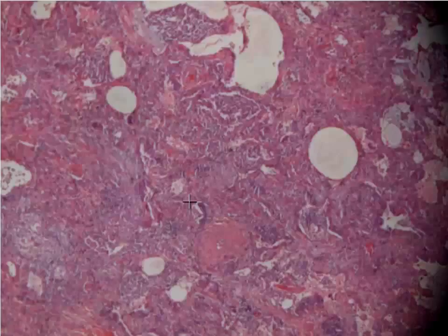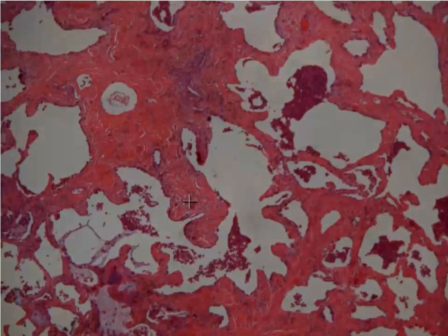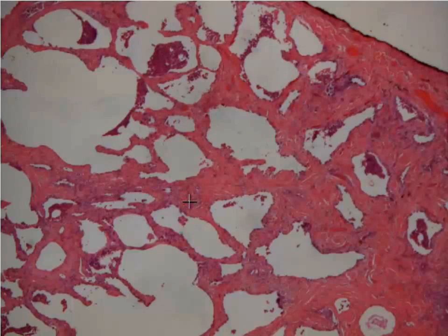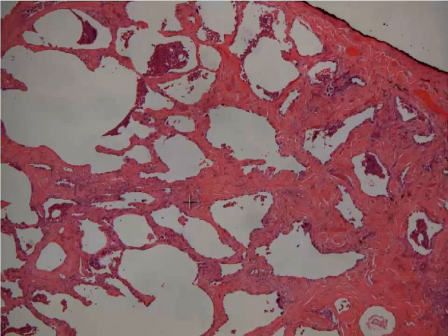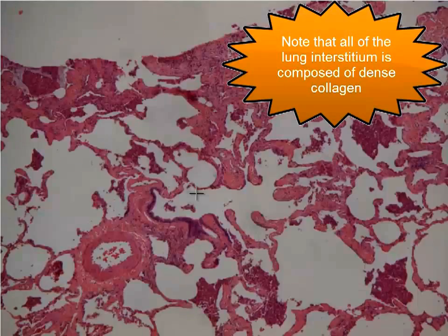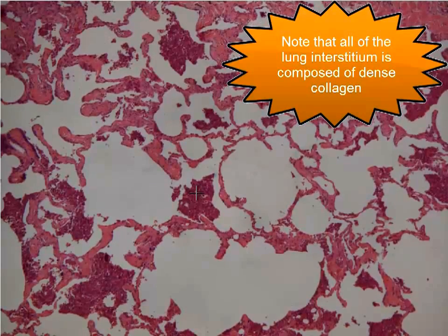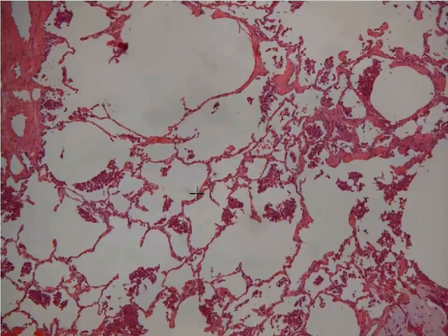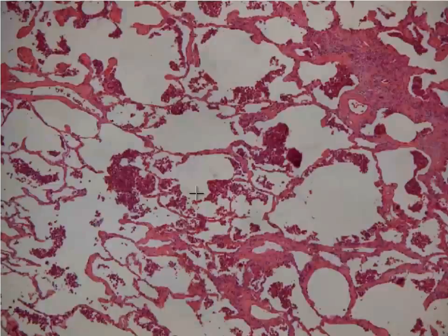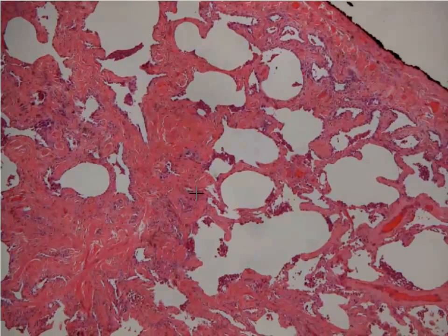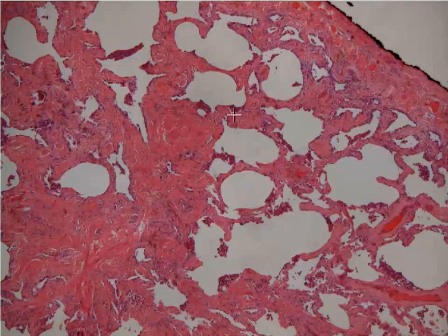What happens in that case is you end up with what we would call honeycomb lung. This is an example of a different slide, a different patient, but with the same disease — much more advanced. You can see that the alveolar spaces in this patient show temporal heterogeneity, with some areas looking okay, but in other areas the lung has been completely remodeled to honeycomb lung, where the alveolar spaces are large and cystically dilated and surrounded by these areas of dense fibrosis.